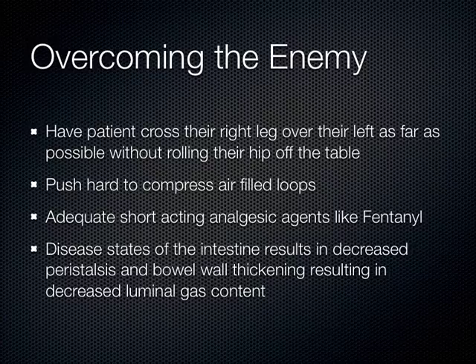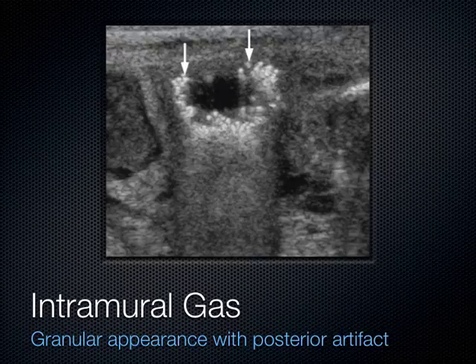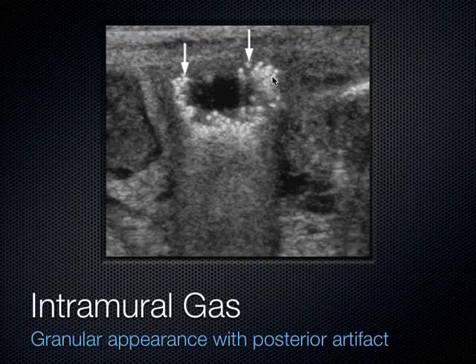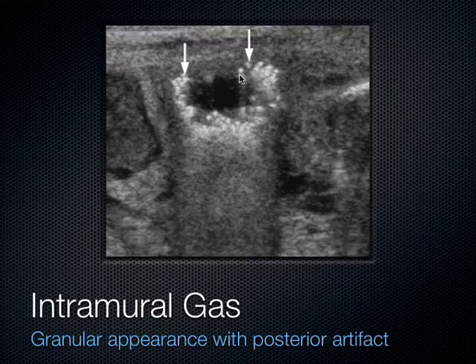This is what it looks like when you have air in the wall of the bowel — a very sick bowel. This is what necrotizing enterocolitis looks like: you get intramural air appearing as little punctate areas. Sometimes we see comet tails — a reverberation artifact that goes toward the bottom of the screen. You see that with air, and sometimes metal, but air classically causes these comet tails.